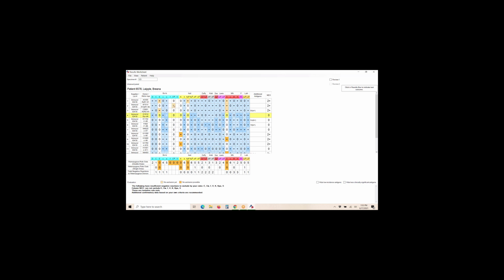CW is a low, and typically it's not going to be the lows. I mean, we do get them, but when you have all of this type of reactions, usually you have your common alloantibody and not a low. Same thing with V, same thing with KPA. So we're going to move to the K now.